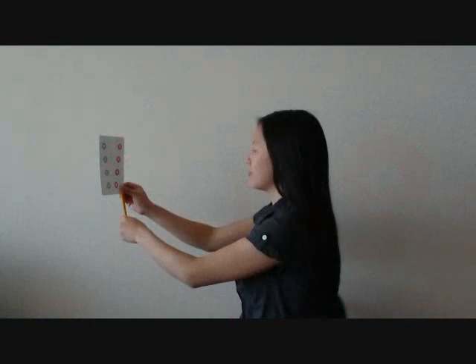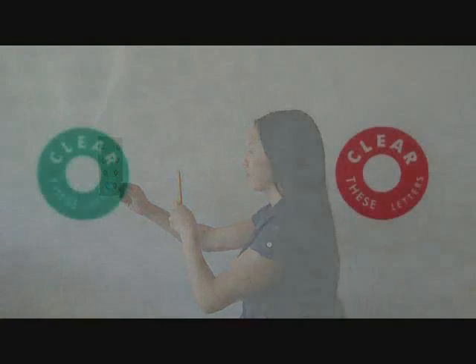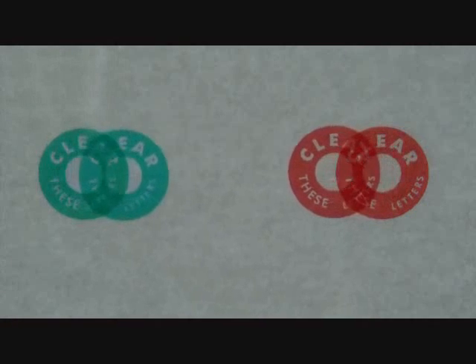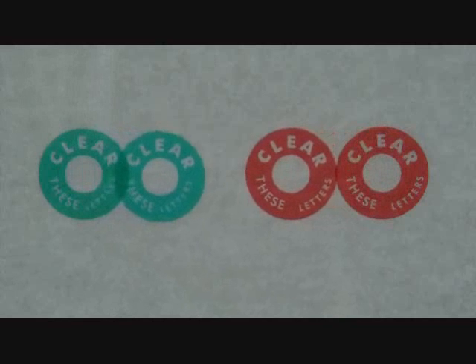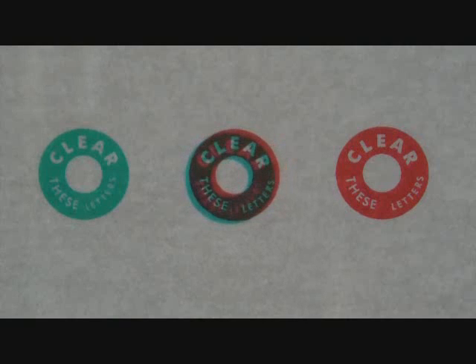Look at the pencil tip and keep it single while moving it closer to your nose. As you move the pencil close to you, you should notice two circles at first, then four, then three, with the middle one being a mixture of red and green colors.